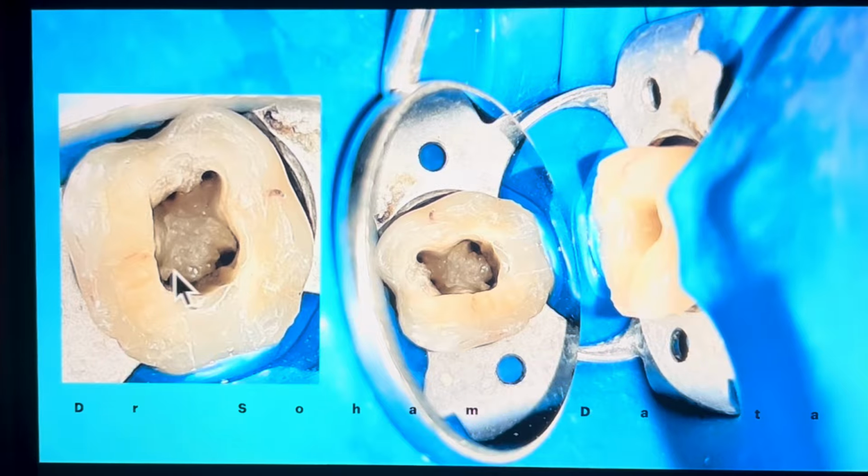And if you see the floor, you won't find any kind of groove because of the attached pulp stone on the floor here. Now if you see that, here is the distolingual orifice. So while I am preparing an access cavity in this case, I have to cut some amount of extra tooth structure here. Otherwise, if I go from this mesiolingual orifice straight like this, I miss the distolingual orifice. So you have to cut a little bit extra from the distolingual side in order to find the distolingual orifice.